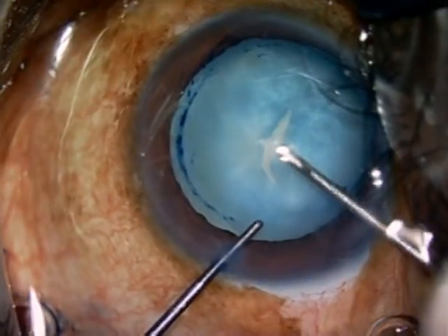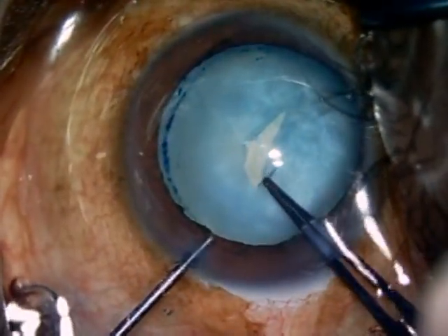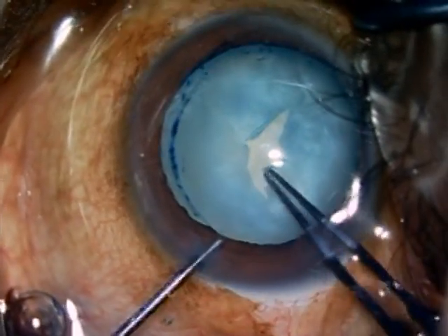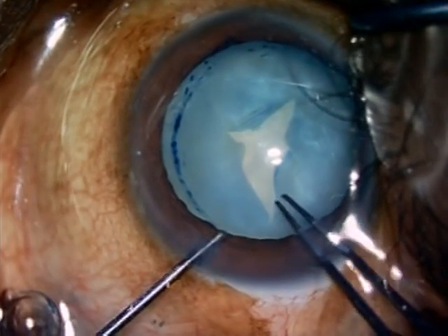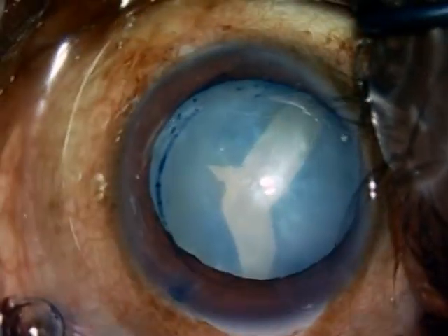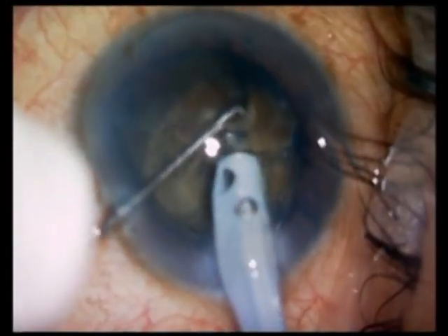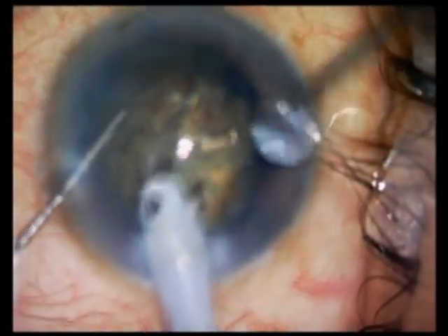The problem with the Argentina flag sign is that the rhexis, because of the extension, can extend across the equator and go to the posterior capsule, thereby producing a posterior capsule rupture or even a nucleus drop, as you can see in this particular video.